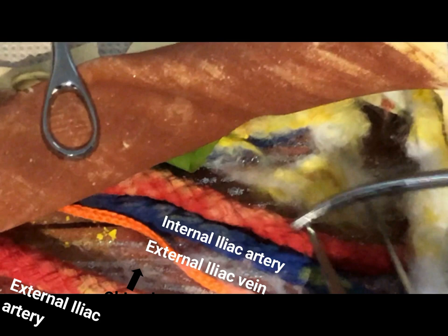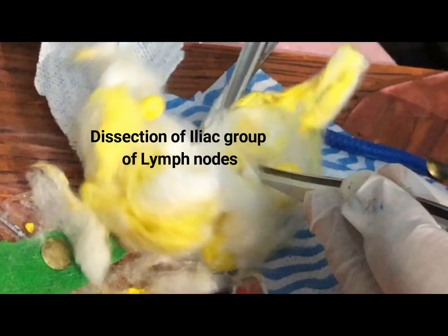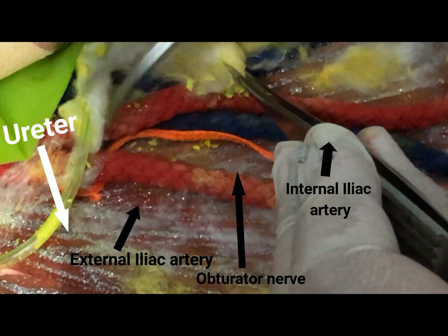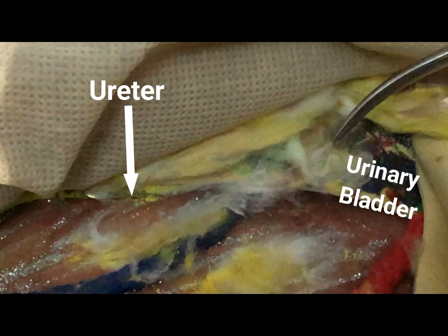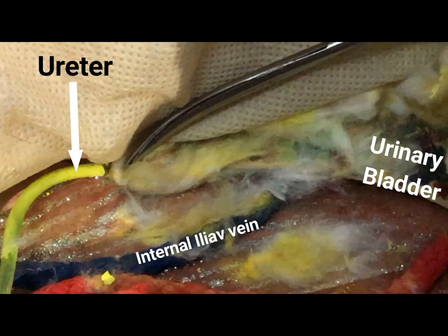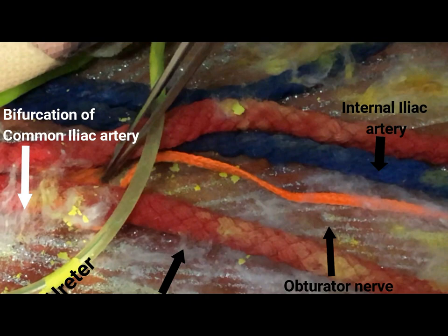It's important to understand that the inguinal part of the dissection does not stop at the inguinal ligament. The lateral limit is the sartorius, medial limit is the adductor longus, and the floor is pectineus and iliacus laterally. Part of the adductor longus also becomes the floor medially, and it goes at least two centimeters superior to the inguinal ligament onto the external oblique aponeurosis. These lymph nodes are the superficial chain and include the Cabana dissection. Certain conditions like cancer of the penis may not be very radiosensitive, so surgery is the only modality of treatment, and we need to get a clear margin.